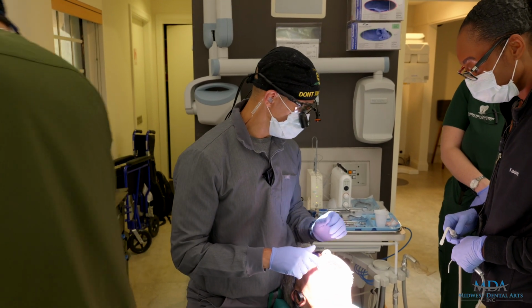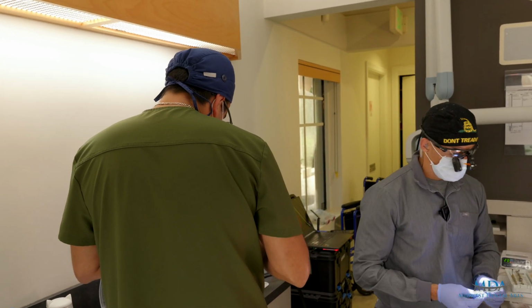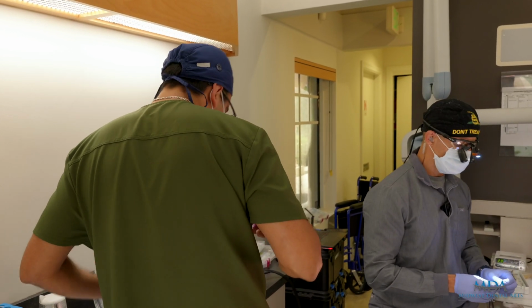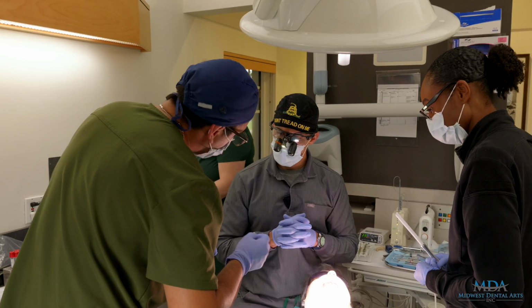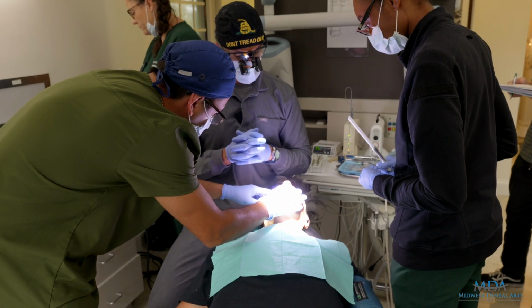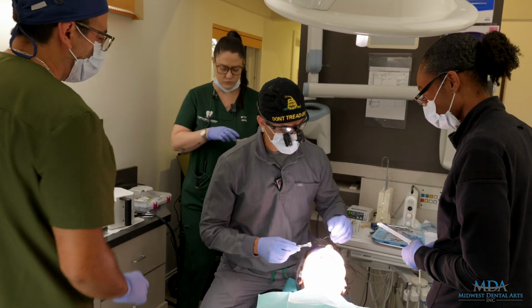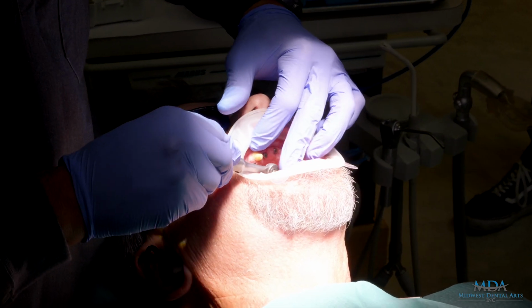Okay, so we have a straight and we have the height. Yeah, this one's a 2.5 on the straight. There are 2.5s. Okay, so here we go. Tightener. This will fit right on top of this multi-unit, and you can give it a final torque. Okay, so final torque for straight multi-unit abutments, we want to go to 30. I'm gonna start at 20 and kind of work our way up. Yes, sir. Definitely. Going to 30.